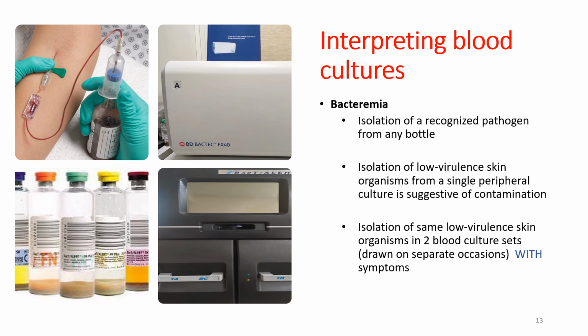It occurs transiently or intermittently. Hence, samples need to be taken an hour apart from both hands, and should include both aerobic and anaerobic bottles. If a particular organism is isolated from the left hand but not from the right hand, then depending upon whether that isolate is a pathogen or a contaminant, the blood cultures need to be interpreted accordingly, in correlation with the clinical signs and symptoms.